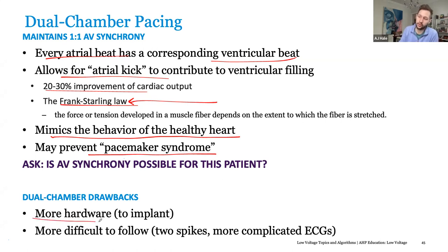What are the drawbacks? It's harder to put in. There's an extra lead. There's more risk of occlusion. It's just things to consider. And then obviously dual chamber modes, we're talking DDI, DDD, are more complicated. So for the people who are going to support this in the field, it's something to keep in mind. It's not necessarily going to be the easiest thing to regulate.